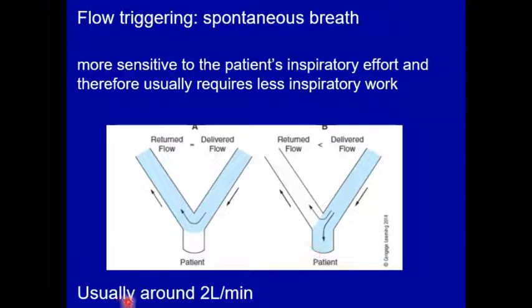Usually it is kept around 2 liters per minute. That means whenever the change of flow from the inspiratory to the expiratory limb is around 2 liters per minute, then inspiration is triggered.